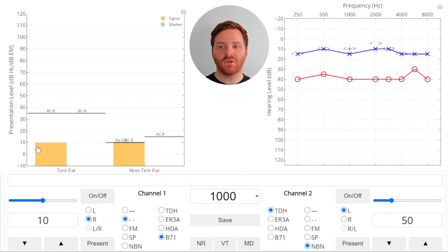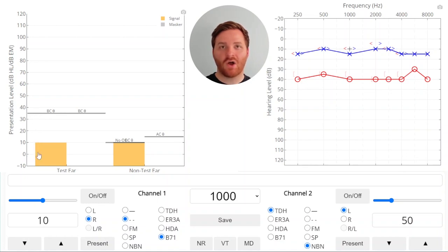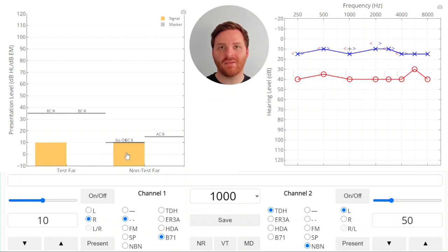If you look over at the masking tool, you can see that in the test ear, or the right side, we played a 10 dB sound. That 10 dB sound is nowhere near the true threshold for bone conduction for the right ear or the test ear. But that bone conduction sound also stimulated the left ear, or the non-test ear, at a 10 dB HL level, which is where the threshold is on that side. So this is why the patient responded — they didn't respond because we're at the threshold in the right ear.